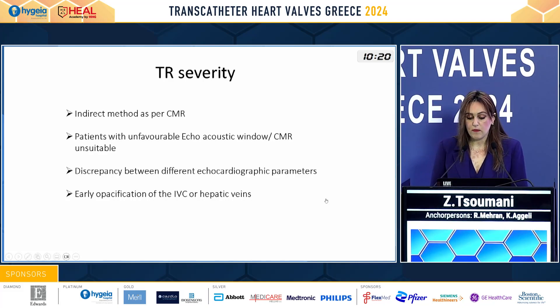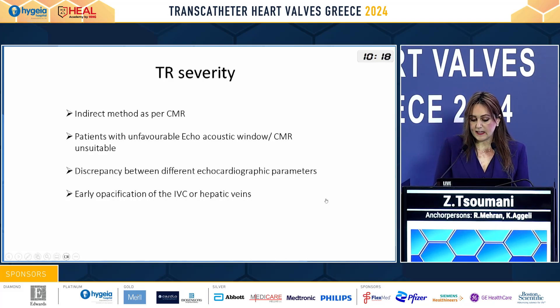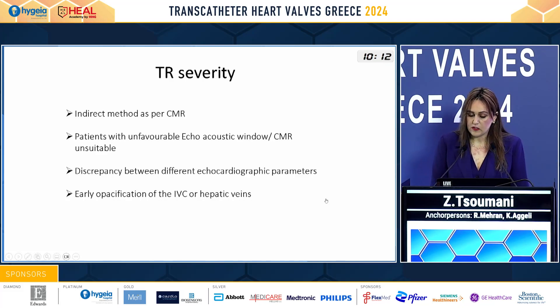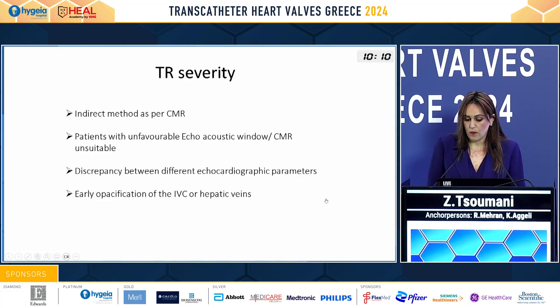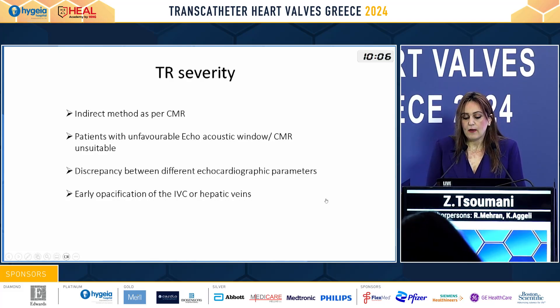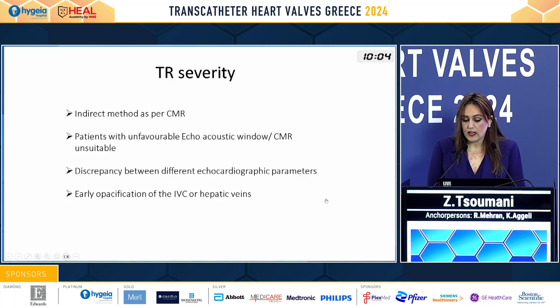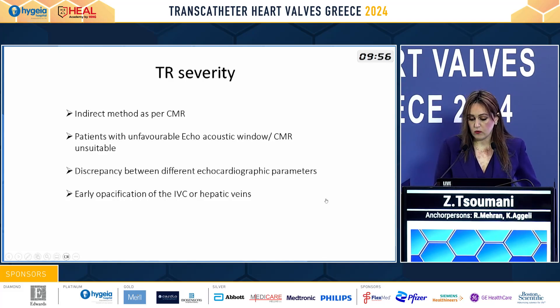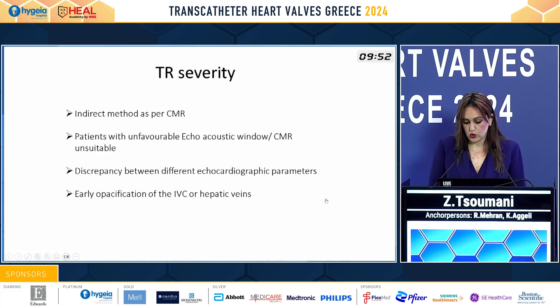Using this volumetric method, we can have an indirect method of TR severity — as per CMR — by subtracting the left ventricular stroke volume from the right ventricular stroke volume, provided we don't have any cardiac shunt or significant valve disease. This may be helpful in patients with unfavorable echo acoustic windows when CMR is not an option.